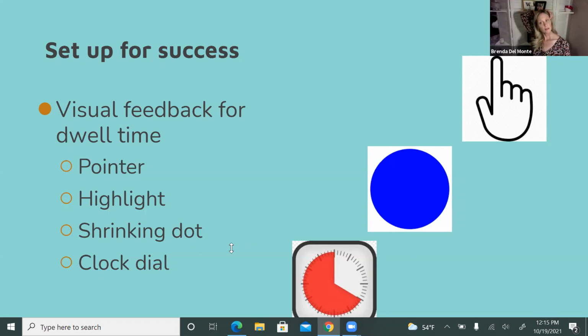Well, the other thing is that the Tobii in the video was an older one, and now they don't have the buttons on the side. They have those indicator buttons on the front of the camera, but they still have those same two things: you can hit the button and see the eyes anytime, and hit the button and pause the eyes at any time. So I apologize that the video is a little bit outdated on that hardware, but I thought if your district or any kiddo has a device from the last 5 years, that's the one you're probably looking at anyways.